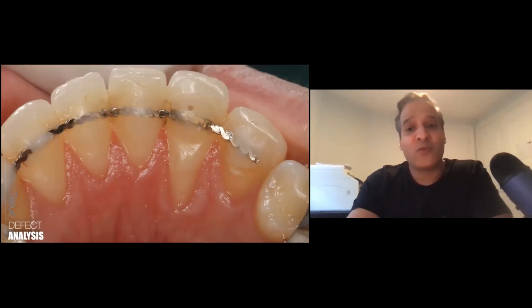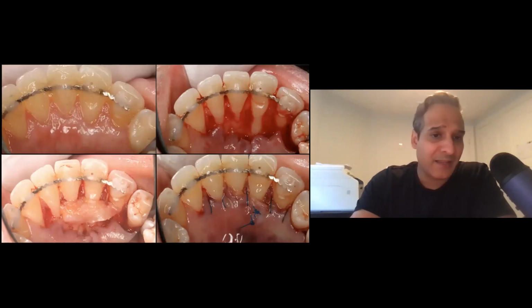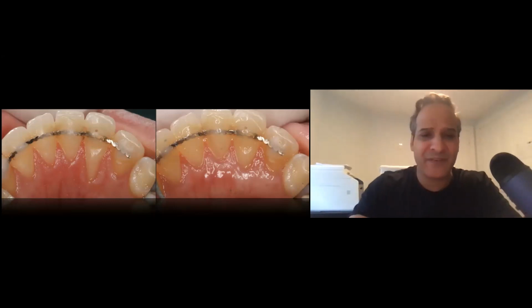Again, same thing, we even treat lingual recessions. In this case, they can be done, I usually do it either by a coronally positioned flap with connective tissue or a tunneling approach. In this case, we use a coronally positioned flap with connective tissue graft, release the flap, sling it, close up the site, and we get a nice healed result. So very predictable. Again, when I look at these cases, I always look at the interproximal bone loss. So everything is healed nice and looks predictable, and these are more of a pain to actually treat because of the way it looks.